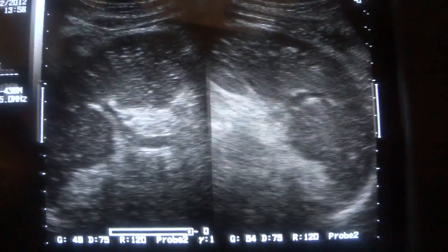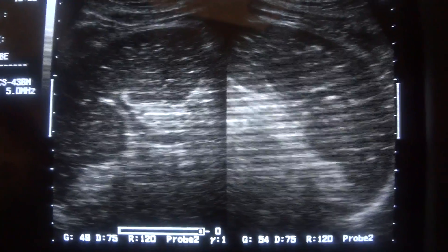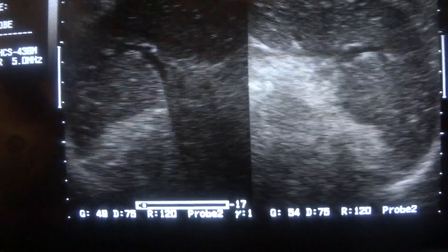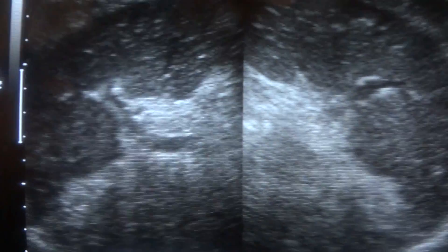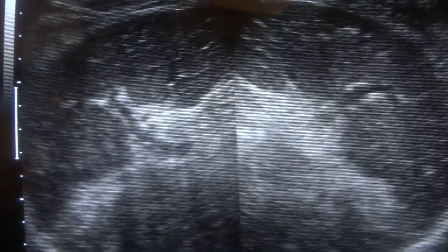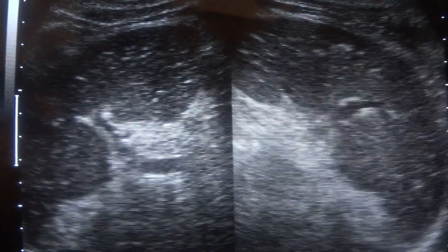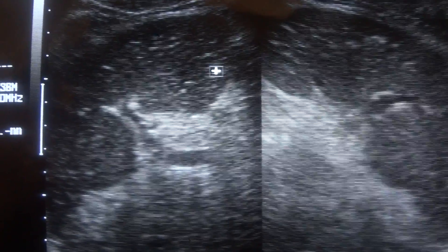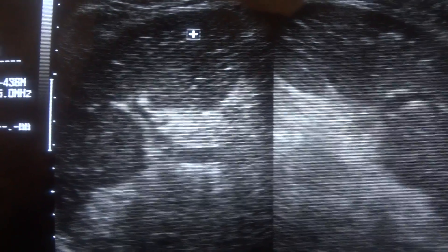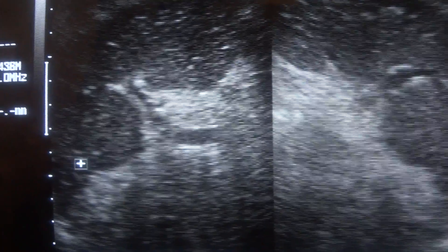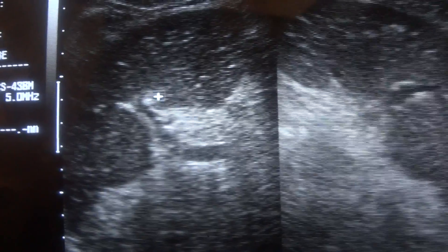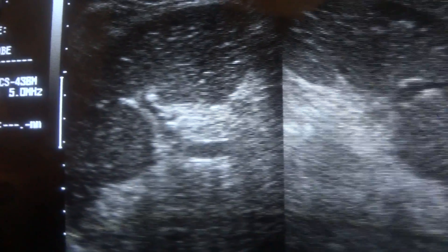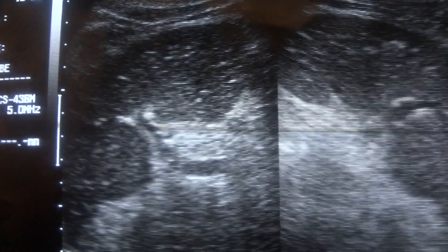This video segment relates to the diffuse, decreased parenchymal echogenicity of the spleen. From both angles, as we see a starry liver — in the same way, these bright, tiny echogenic areas, looking like stars behind a black background, are the vessel radicals within the splenic parenchyma, just as you see in the liver.